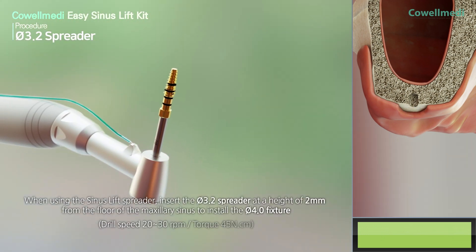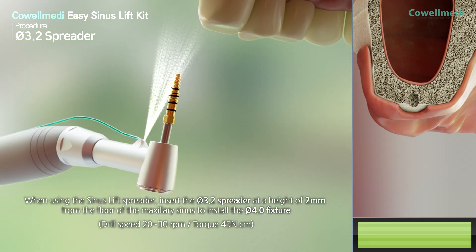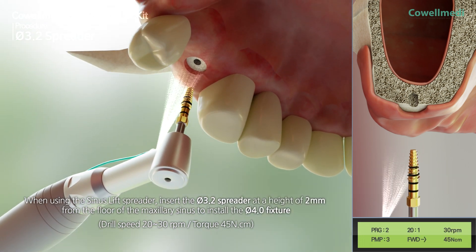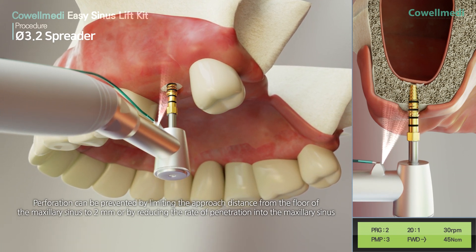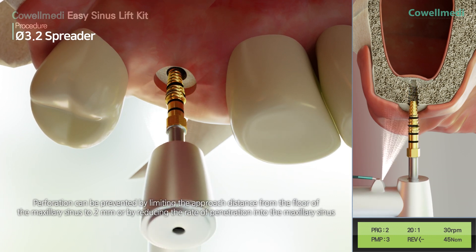If the sinus lift spreader is used, insert the PI 3.2 spreader at a height of 2 mm from the floor of the maxillary sinus for PI 4.0 fixture placement. Perforation can be prevented by limiting the approach distance from the floor of the maxillary sinus to 2 mm, or by reducing the rate of penetration into the maxillary sinus.